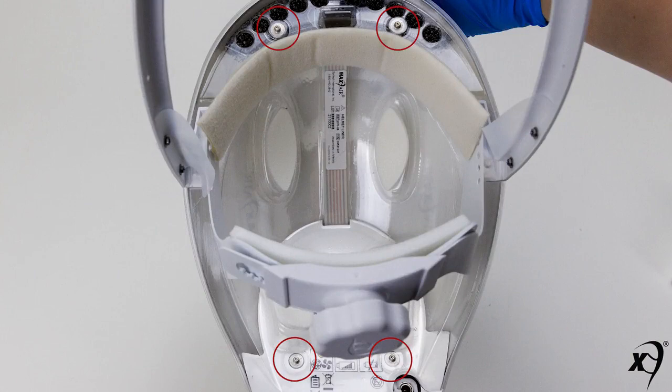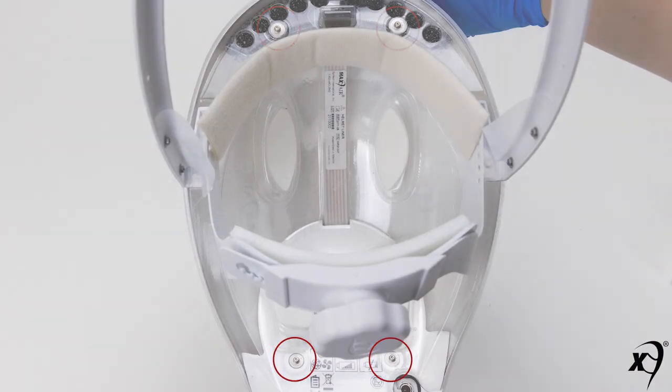The four underside snaps — two in front and two to the rear — are for attaching the liner. Refer to the liner video for more details.